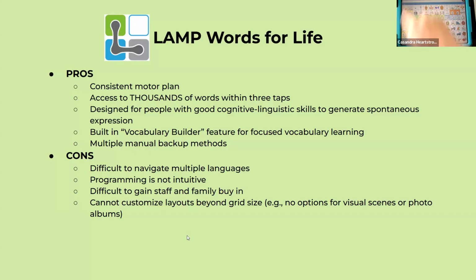One thing that I really like about it is that it has the full version, the one-hit version, and the transition version. So at first, when you first expose somebody to it, it could be the one hit, meaning this doesn't go anywhere. When you touch it, it says the word you want. Have. Do. Said. And then when you jump to the transition, now it just has a few versions.